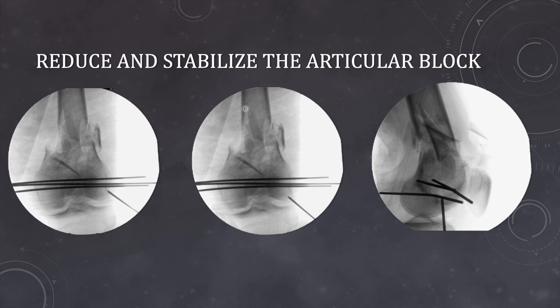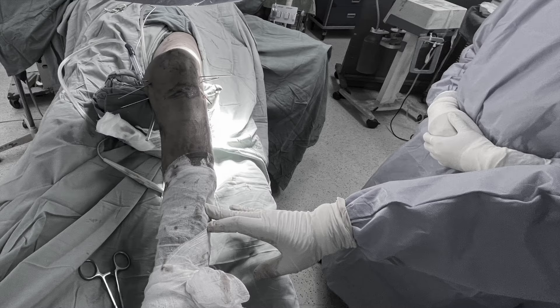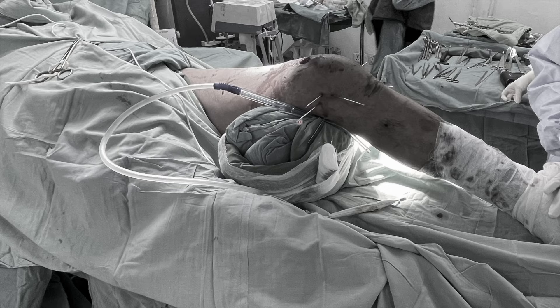The wire should go close to the articular rim and be directed towards the diaphysis. Even if you are not getting good purchase in the diaphysis, there should not be any issue — this wire may remain in the intramedullary cavity and contribute to stability. This was the lateral wire going into the diaphysis. After checking whether the AP alignment is good, you can pass a medial wire from the medial condyle towards the diaphysis. Now you have secured the assembly of the articular block to the diaphysis in both AP and lateral views. These wires from the lateral and medial sides are actually going to hamper your implant placement, so you can just push these wires so that the lateral surface of the articular block is free from any wire prominence.